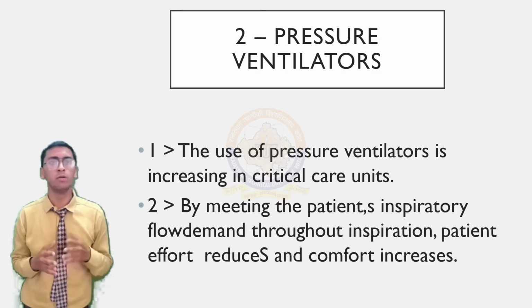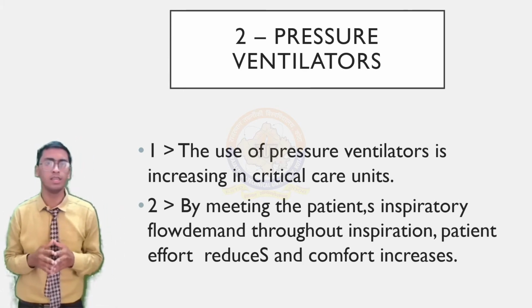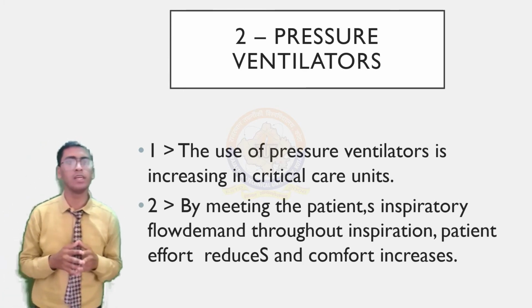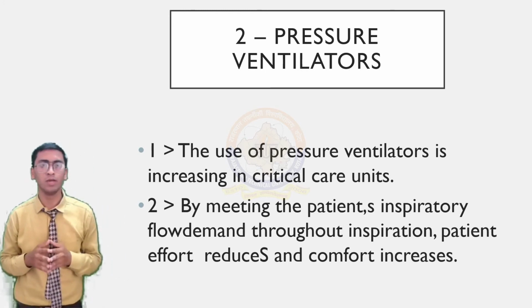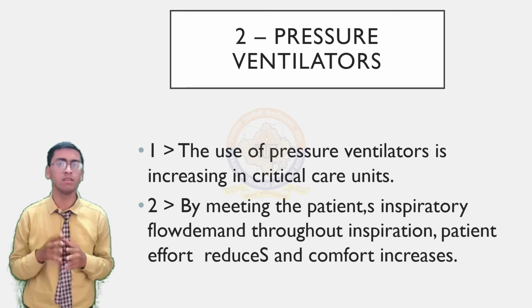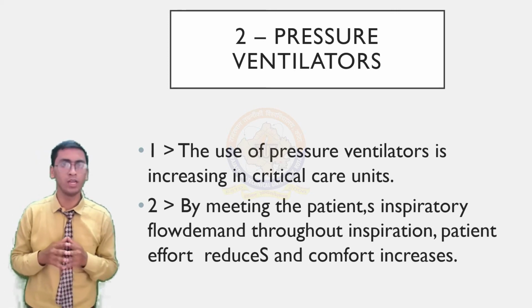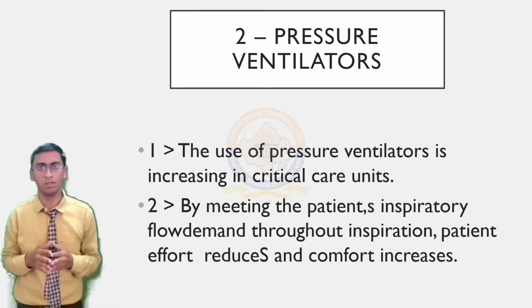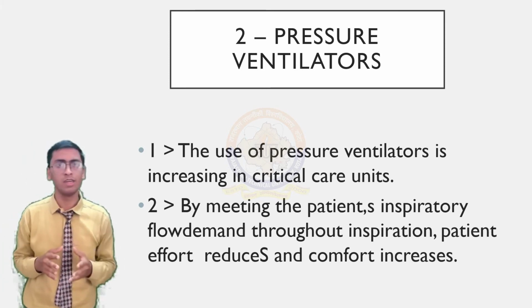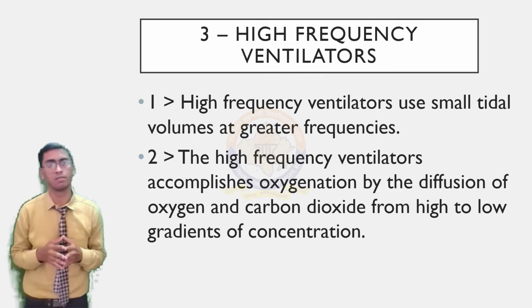Now moving on to pressure ventilators. The use of pressure ventilators is increasing in critical care units. By meeting the patient's inspiratory flow demand throughout the inspiration, the patient's efforts reduce and comfort increases. With pressure modes, the pressure level to be delivered is selected, and with some more options, rate and inspiratory time are present as well.